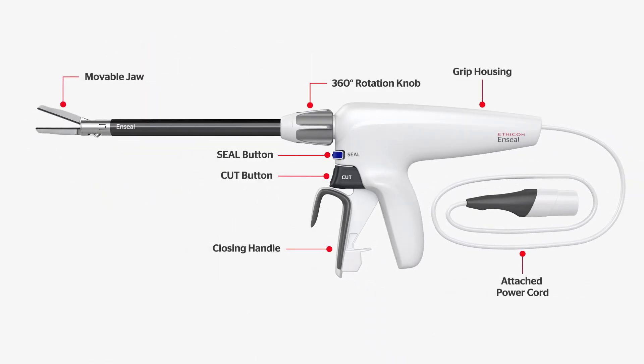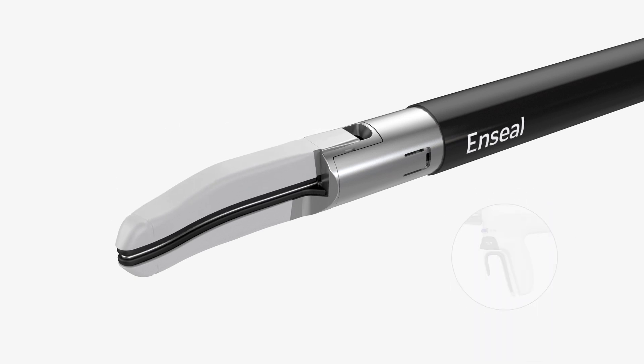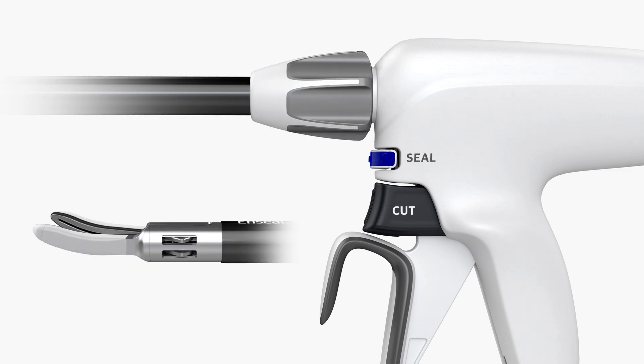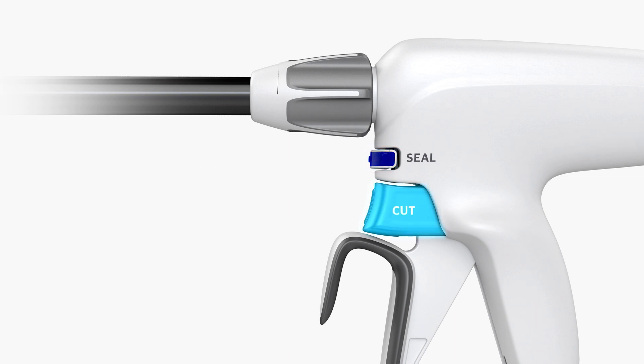The instrument consists of a movable jaw, 360-degree rotation knob, separate seal and cut buttons, closing handle, and grip housing assembly with attached power cord. The curved jaws are in a normally open position and can be partially or fully closed by squeezing the handle. The jaws are designed for grasping and holding targeted tissue when clamped. The instrument shaft can be rotated 360 degrees to facilitate visualization and enable easy access to targeted tissue. Bipolar energy is delivered when the seal button or min foot pedal is pressed. Pressing the cut button advances the knife the length of the jaws to cut the targeted tissue.